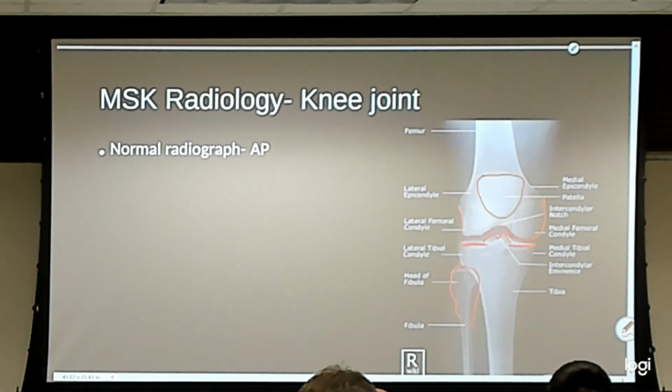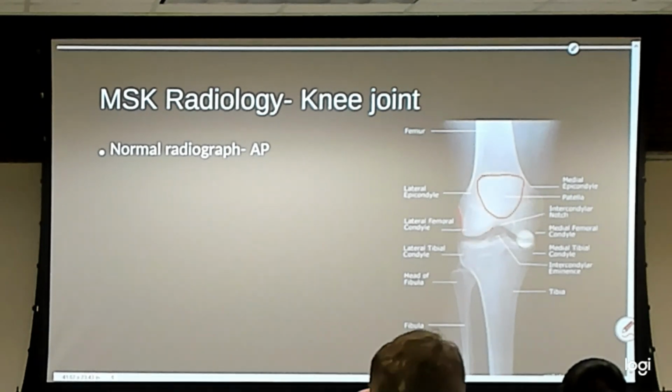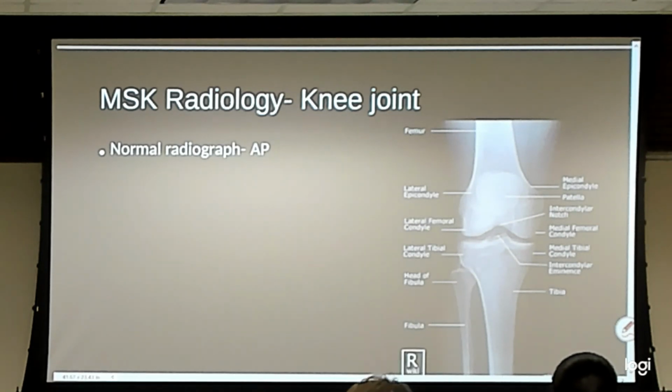So think of that. Typical map plateau. Geology, sure. Flat top, tabletop. That's what we're talking here. Once you get those tibial spines out of the way, the rest of it is very flat. So that's how it earned its name of tibial plateau. Any questions on any of those items? Okay.